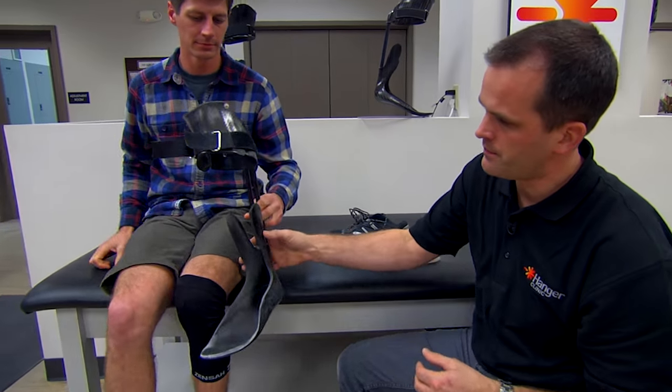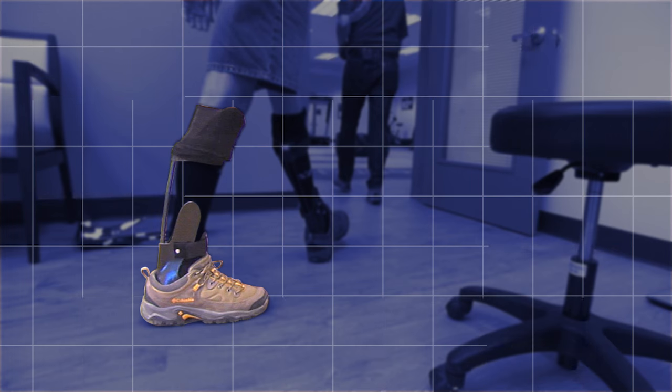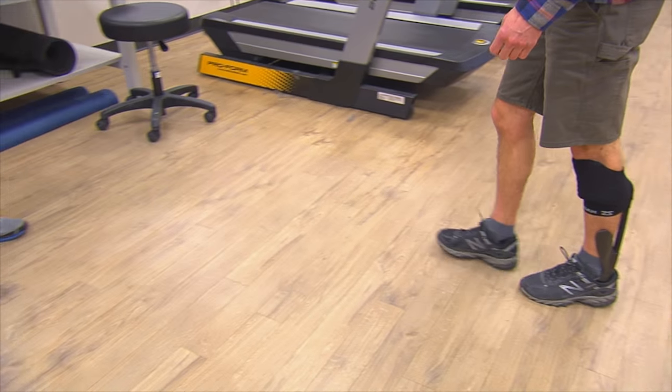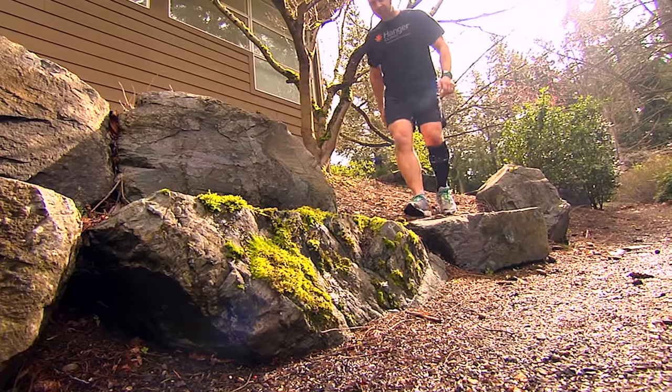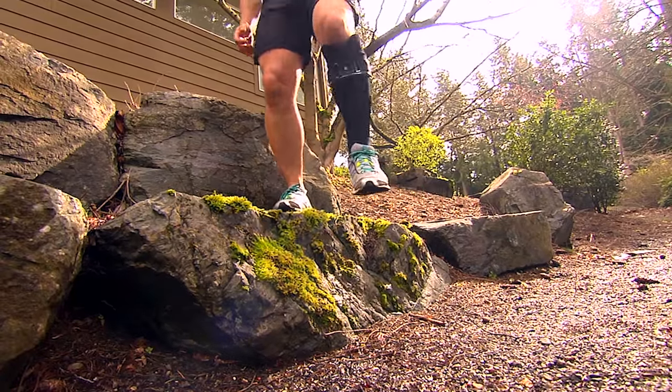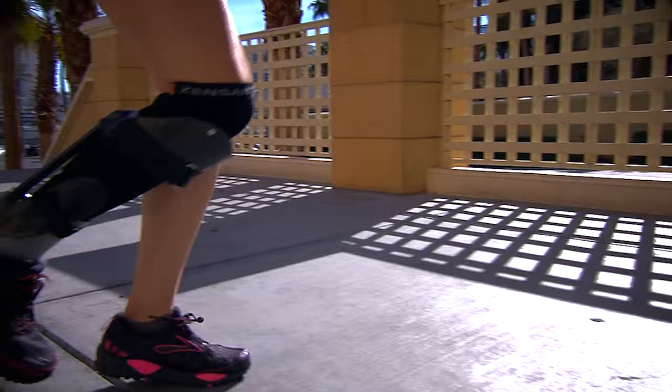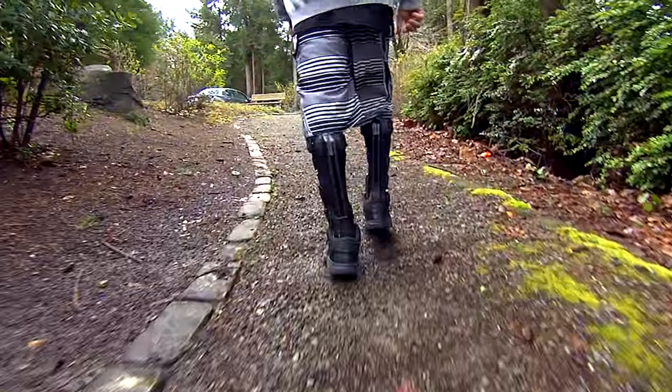The Exosim is a device that was designed after the concept of a prosthesis — the storage of energy through the back section of the struts of the device. That energy is created from a reaction of the knee section, the upper section around the patient's knee area. Then through that deflection and power as they advance through the gait cycle, that foot has a rollover shape that gradually engages the strut through the knee section and advances them to the next step, much like a prosthetic foot or even a prosthetic run foot. So there's energy storage, and in the midst of that energy storage, there's protection of a joint that's injured.